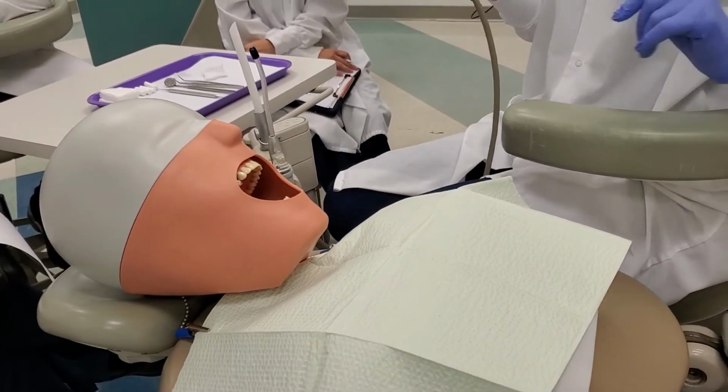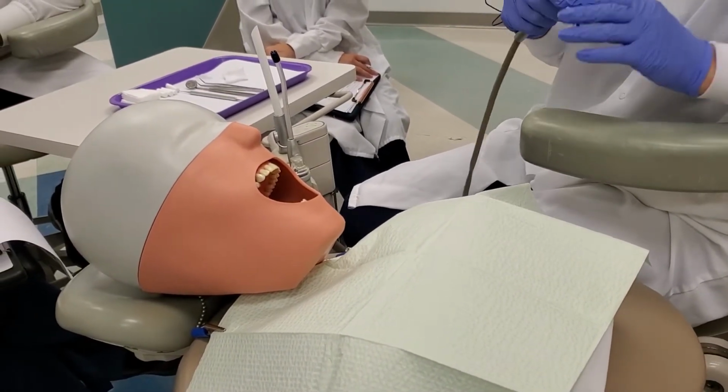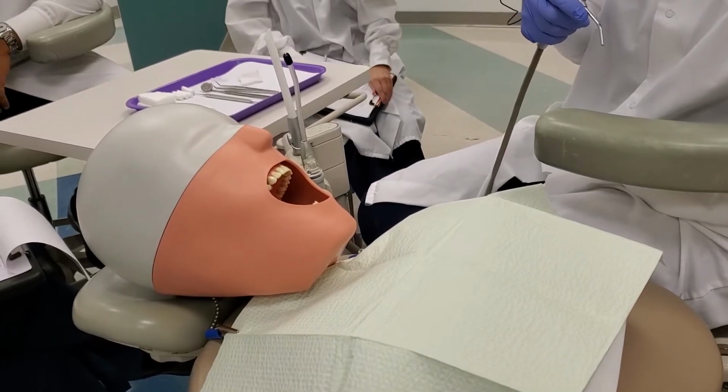Right, that was the easy one. Now, number 3, use the HVE for suctioning when the dentist is working on an individual tooth.